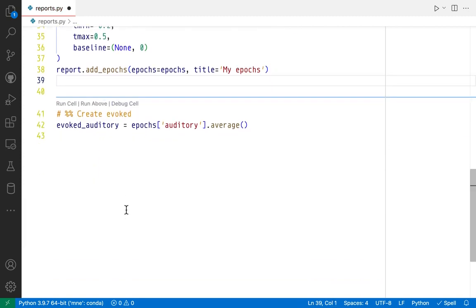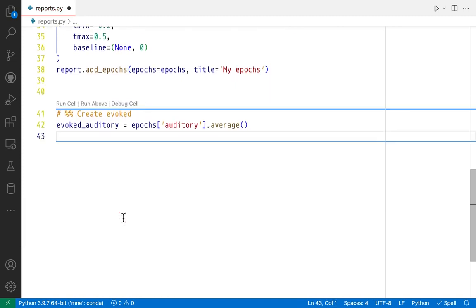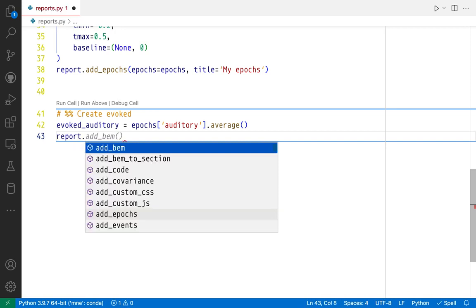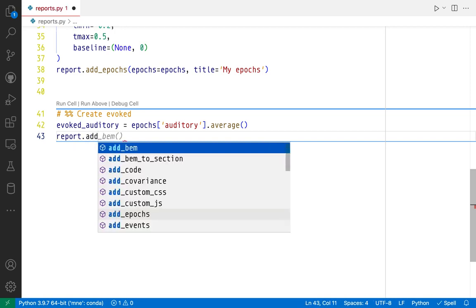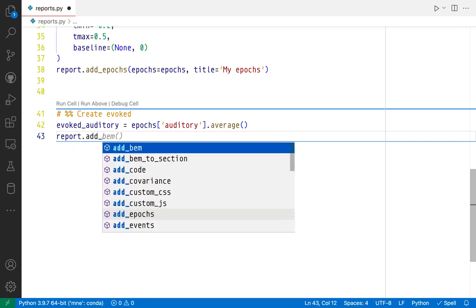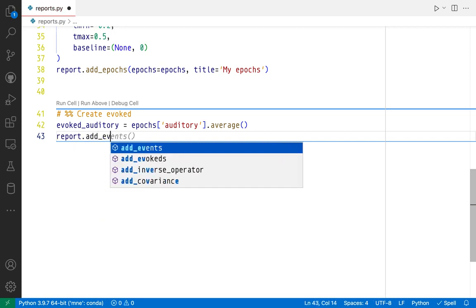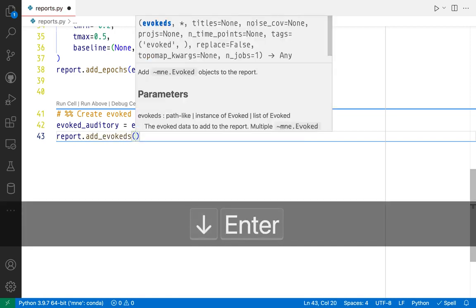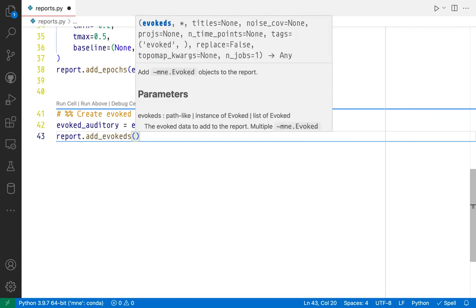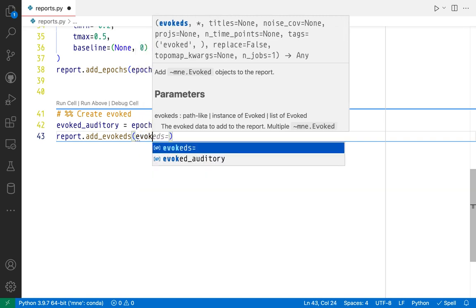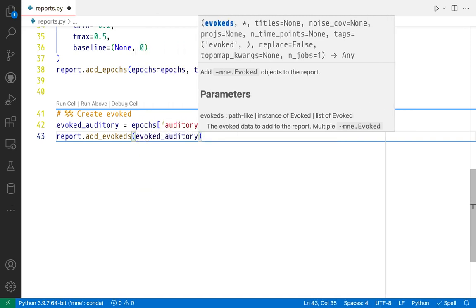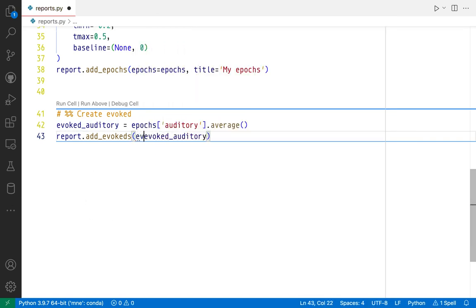And lastly, we're going to add the evoked object to the report using, you guessed it, add_evoked. In this case, we use the plural form because this method is special in the sense that it also accepts lists of evoked objects, not only individual objects, but these work as well. We have only one here, so we're going to pass it.